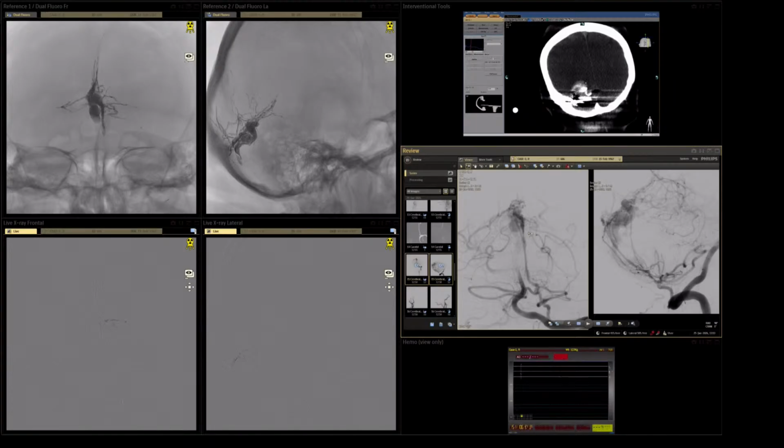Yes, the injection could be from anywhere, but because of the straightforward artery, we decided to take this branch from the posterior meningeal. The navigation was not so complex, that's why. But if there is a middle meningeal artery available, for me the first choice is to go from the middle meningeal.